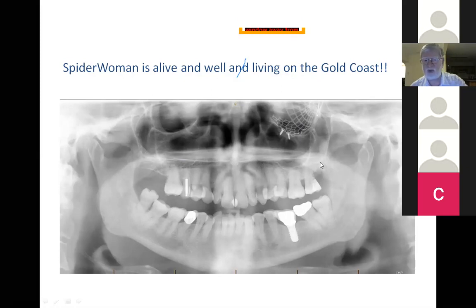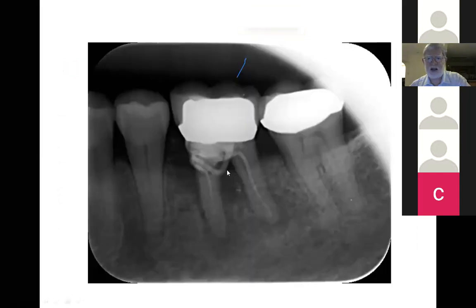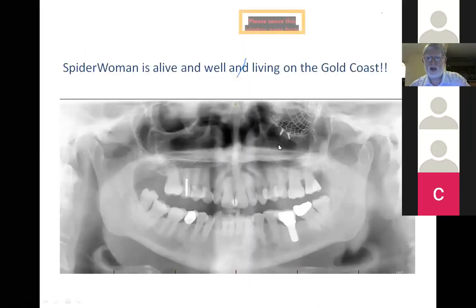Again, earlier I've mentioned, somebody's got 2 hands, 2 arms, 2 eyes. If they lose one, it's significant. But if they lose a tooth like that, you know, it's no big deal. So here we are. There are people, years of, you know, there's probably an orbital fracture. And this is the phenomenal work that our medical colleagues are doing. You know, that's what they're doing. We're playing our bit, and yeah.